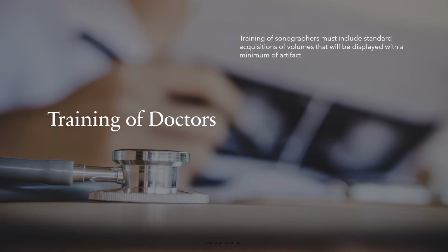A key component of training is helping sonographers recognize inadequate volumes. If volumes are affected by motion or other artifacts, they cannot be used for diagnostic purposes. Sonographers must be able to identify these issues during the scan and know how to reacquire the volume to ensure the best possible image quality.